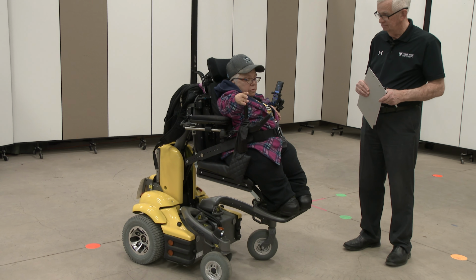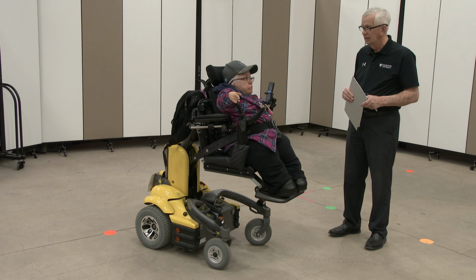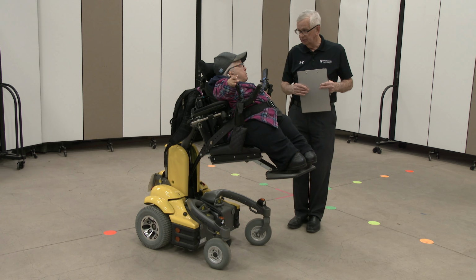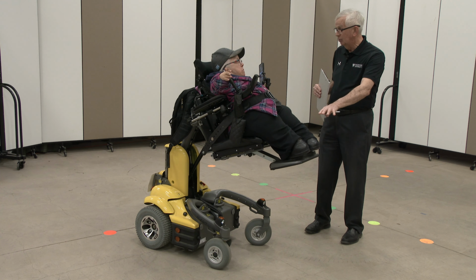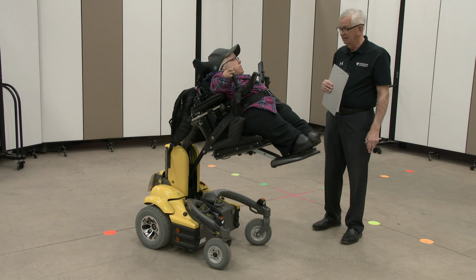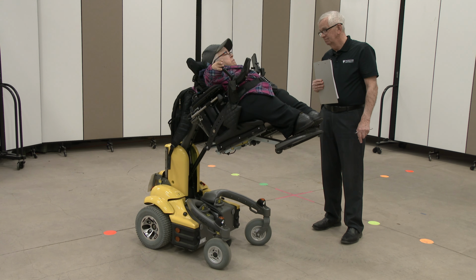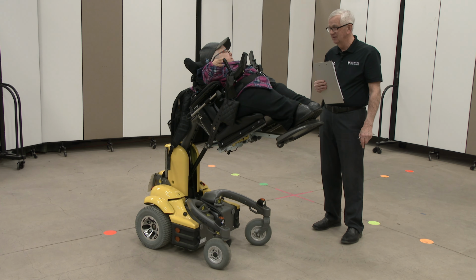Tilt. Just tilt. And when tilting, of course, you want to make sure you're not too close to anything that could get bumped into at the back, but you're well enough forward that's not so much of an issue. You could have a table in front of you when you step up, and you won't hurt your legs doing that. And that's as far as it goes. No, it goes pretty far. Good. And then back to normal.